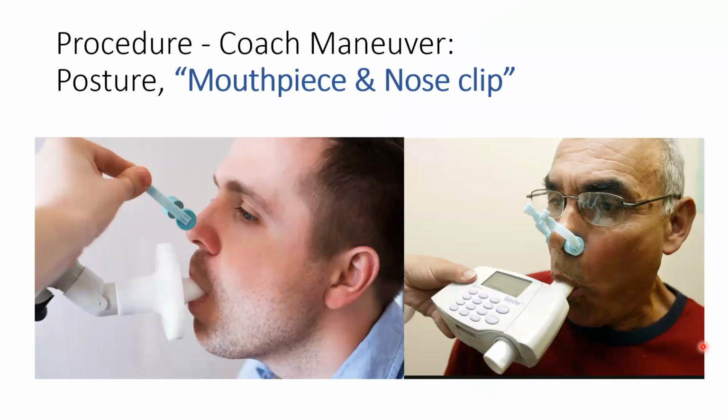Dentures are best left in place because they provide essential support to cheeks and lips. However, if they fit poorly and obstruct the airflow in any way during the maneuver, it is better to remove them from the mouth. The mouthpiece used in the spirometric testing may vary from instrument to instrument. It is essential that the patient puts the mouthpiece in between the teeth with the lips around it so that the air can pass freely and the mouthpiece is sealed firmly by the lips.